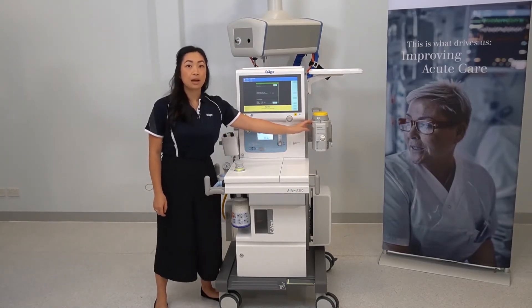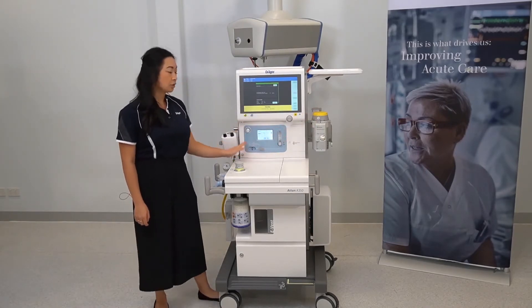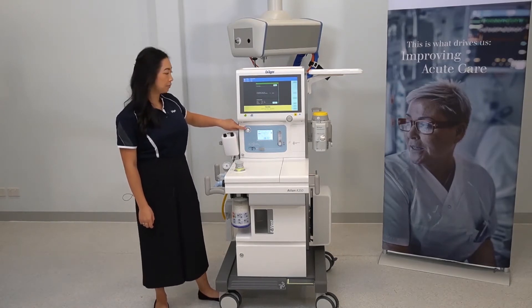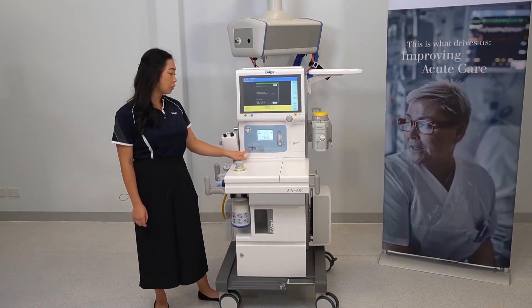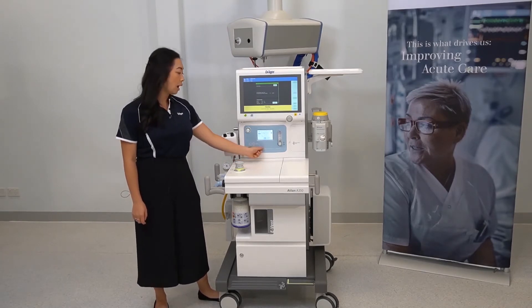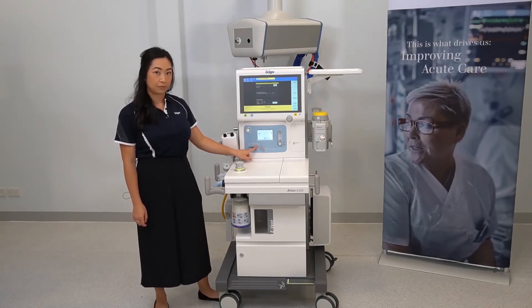To the side is your back bar to mount your vaporizers, and here is your electronic mixing unit. The oxygen flush is located here. This is your auxiliary oxygen flow meter, and this is called the oxygen switch, which will direct your oxygen either through to the oxygen auxiliary outlet or up to the additional oxygen system, which is equivalent to your emergency oxygen delivery.